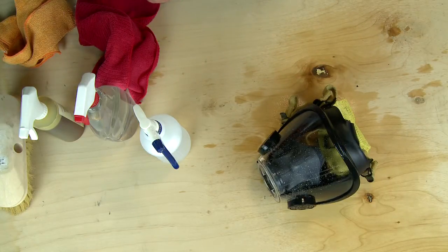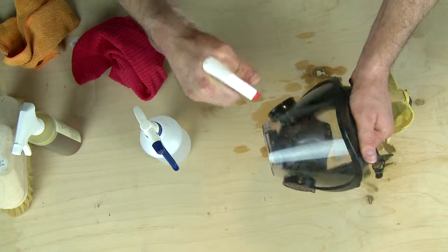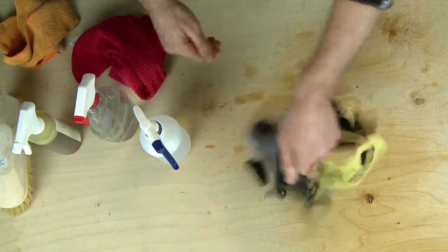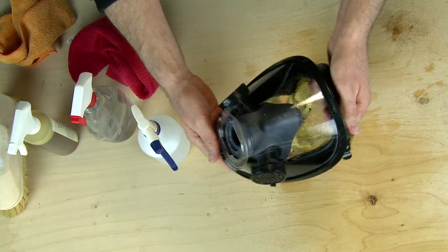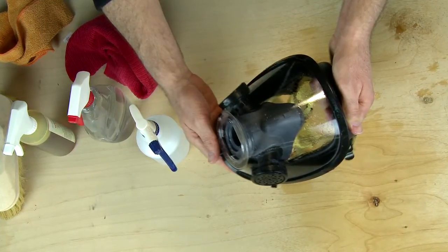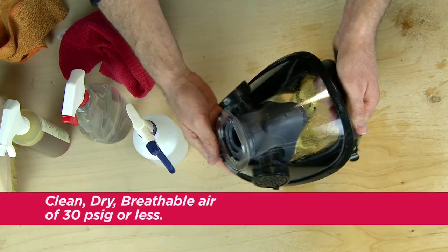Let the mask sit for 10 minutes before rinsing. Rinse thoroughly with clean water using a spray bottle or running water. Shake off excess water. Dry the facepiece with a lint-free cloth or gently blow dry with clean, dry, breathable air of 30 PSIG or less.